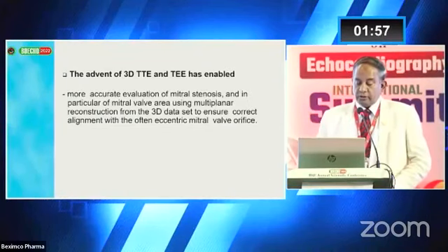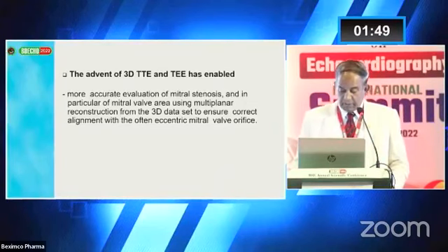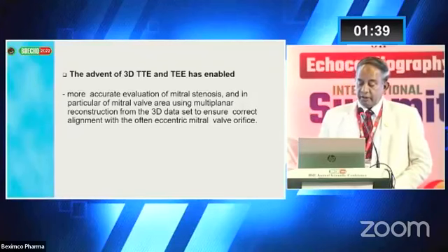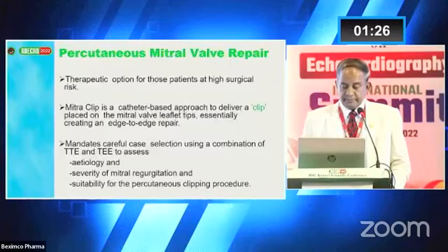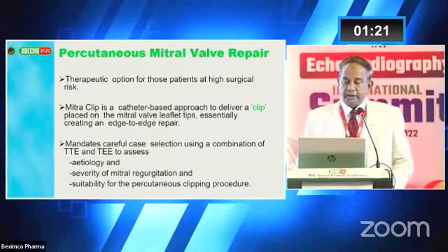In this case, we also use echocardiography in relation to the mitral stenosis intervention for a more accurate assessment of stenosis, and in particular mitral valve area, using multiplanar reconstruction from the 3D data set to account for the eccentric mitral valve orifice. These are slides before and after PTMC. Again there is a reduction of the pressure gradient. Echo also has an important role in mitral valve repair.